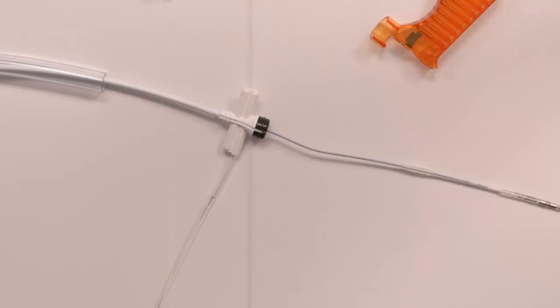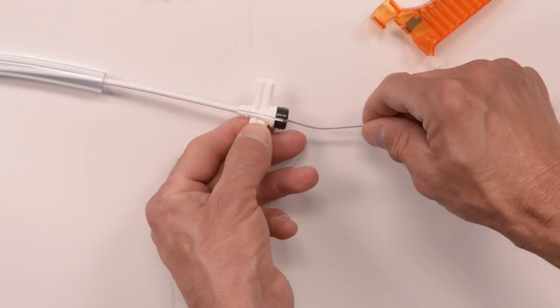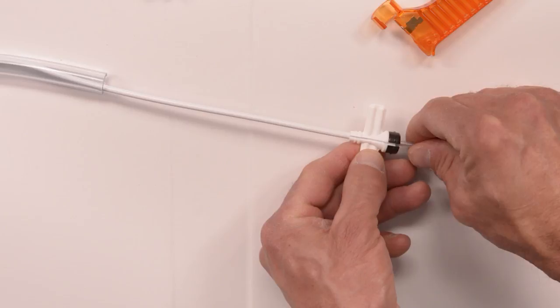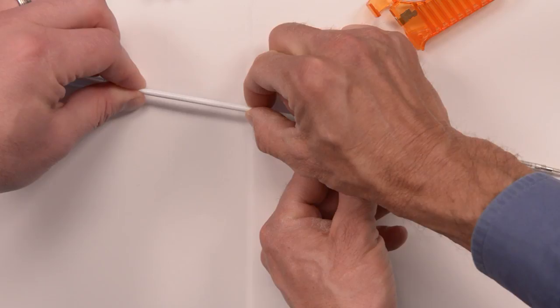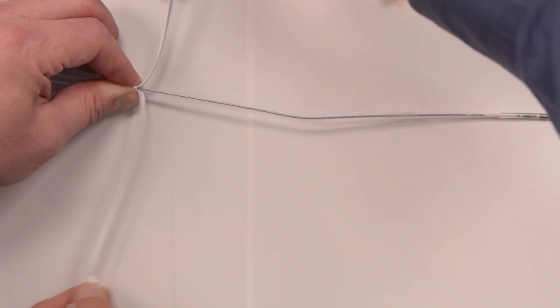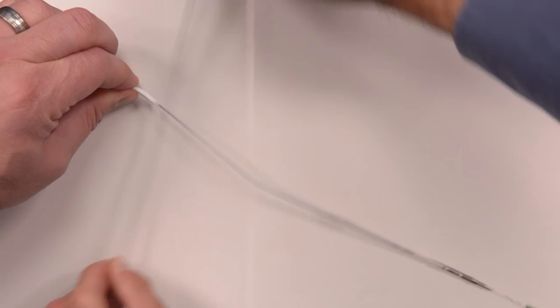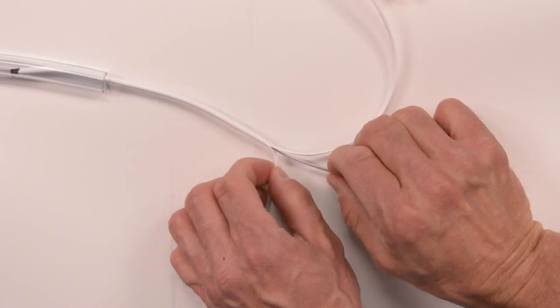Here we go—we're done. The lead is exactly where it was. All we need to do is remove the CSG, which is very simple. The first thing we want to do is just pull it back to the hub of the lead. At that point my assistant is going to hold the lead because this material is so thin that he can actually squeeze the lead inside the CSG. Then we just break, slice down, and once again ease back the CSG keeping the lead in place. Do it one more time, and then the final time—this should get the CSG out. We've got the lead right there, we're done, we didn't move, all is good.